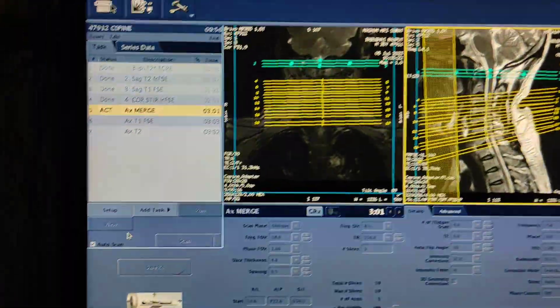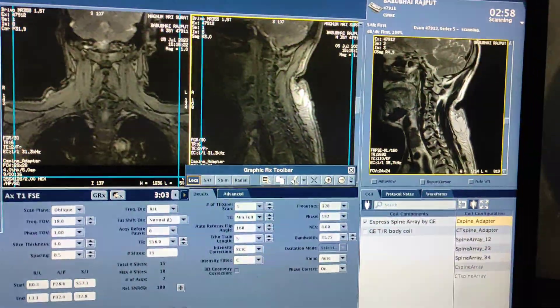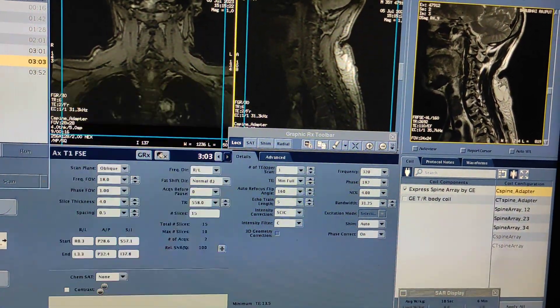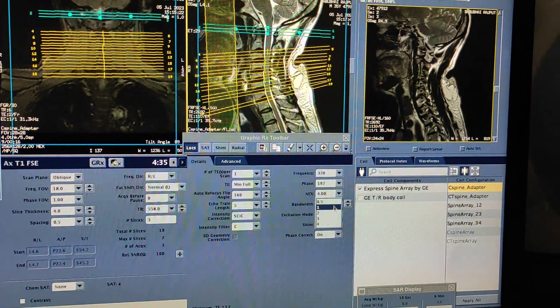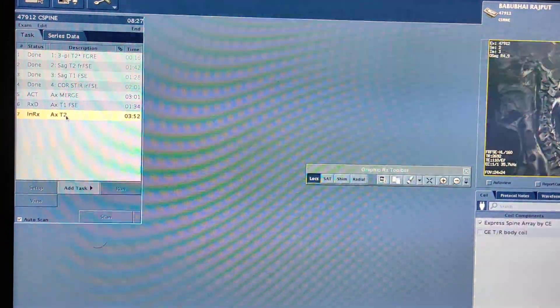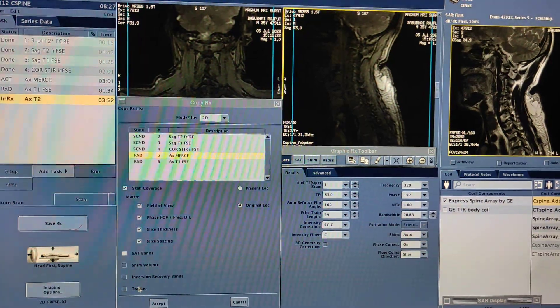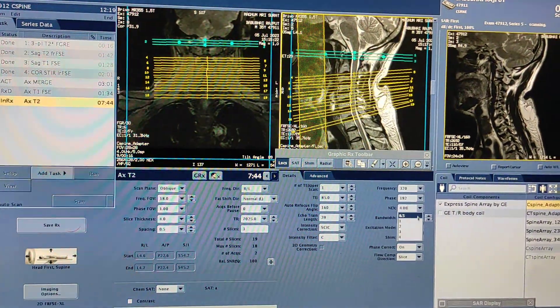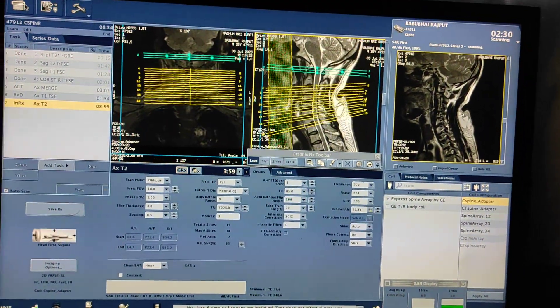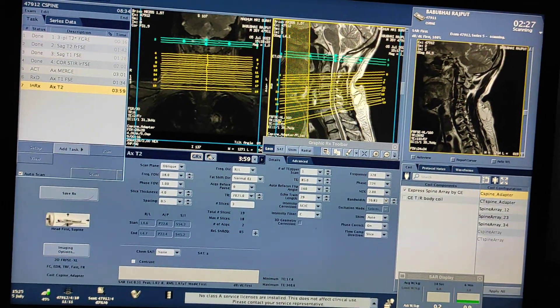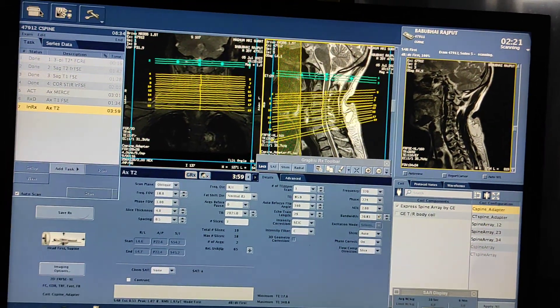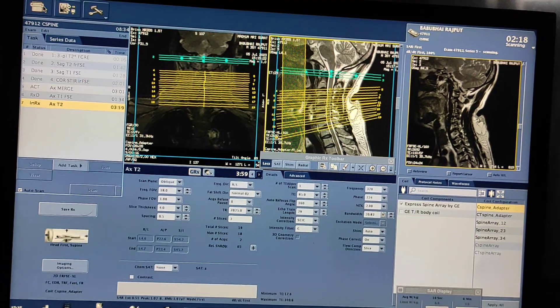The rest of the axial sequences you have to copy with this plan. The gradient sequence has started. Simply click on axial T1 and copy RX from this axial plan. Then again for axial T2 — click open, click on RX, and copy with these axials. So this is how you plan: first SAG T2, copy SAG T1, then plan coronal STIR, then plan one axial properly, and copy the rest of the sequences.